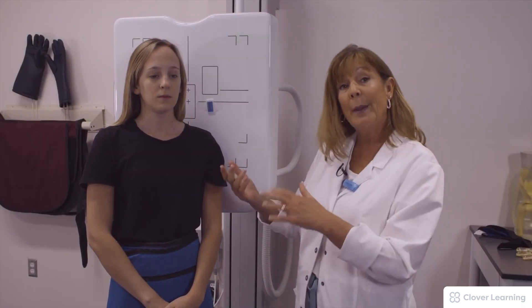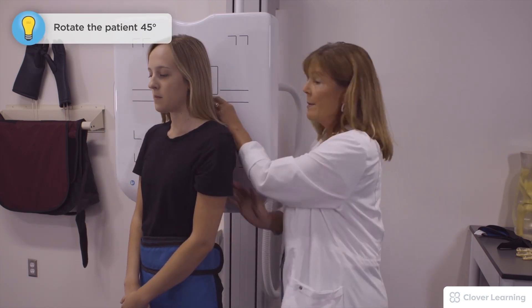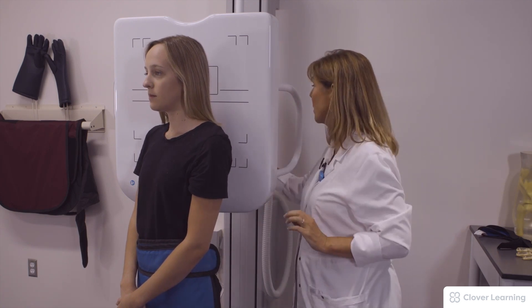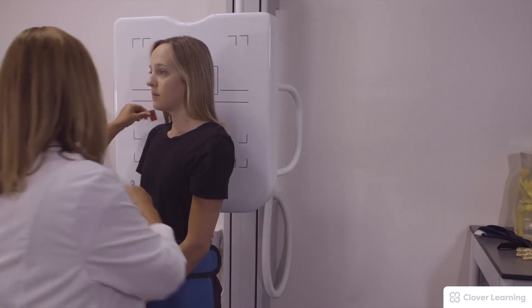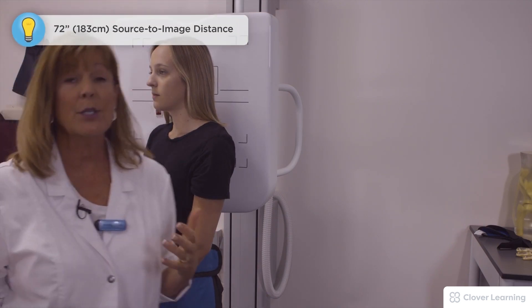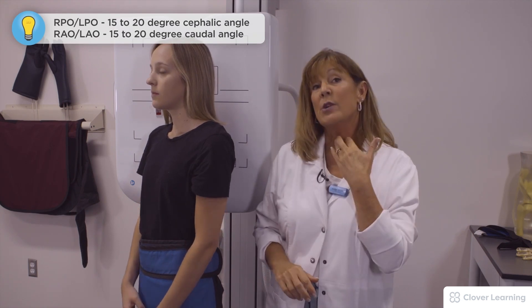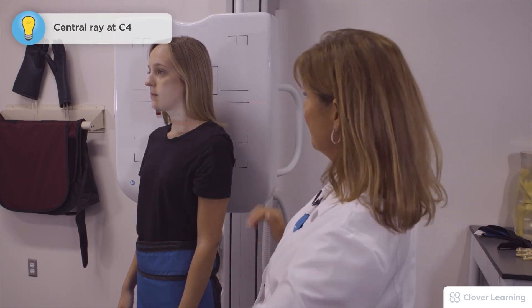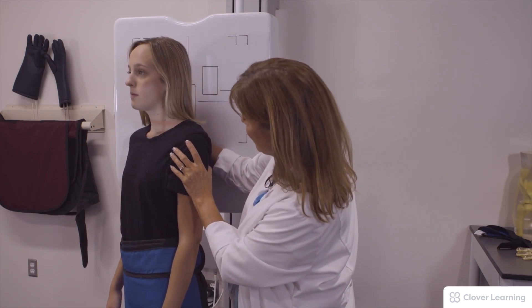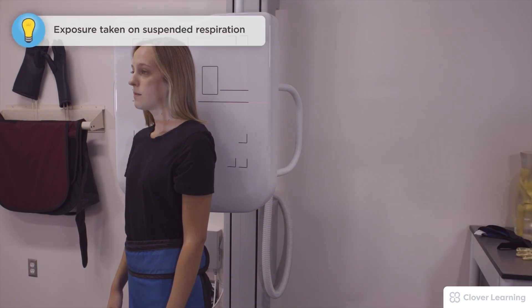Now we're doing the opposing oblique, turning the patient to the right for an RPO, 45 degrees. I'll remove the left marker and place a right marker on the right side. We still have a 72 inch SID, a 15 degree cephalic angle, and are still centered at C4. The patient holds very still and the exposure is made.